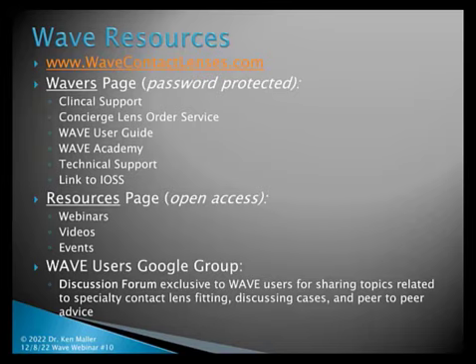However, when I got profilometry, I went back to many of those fits who were already very successful, some of them more than a decade already. And I said, I have some new technology. I'd really like to try and apply it to your lens. I went and got the scleral profilometry, redesigned the lens, and 100% reported better performance of every single lens that I did for them.